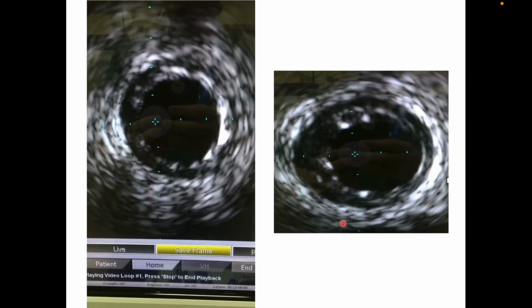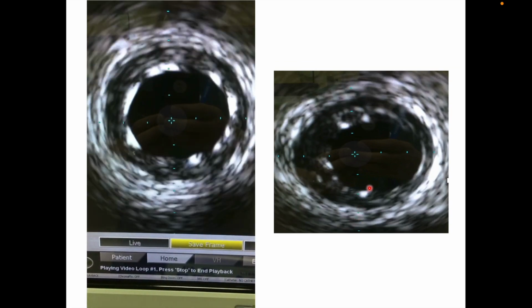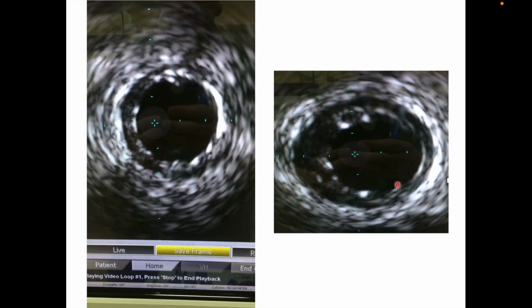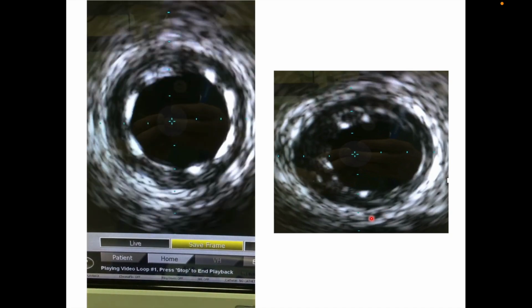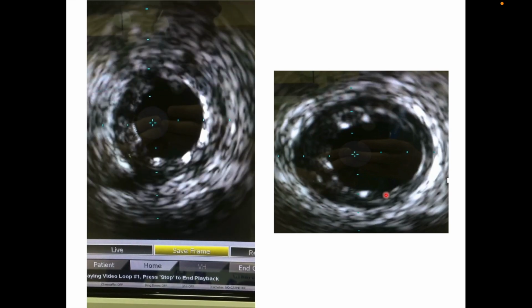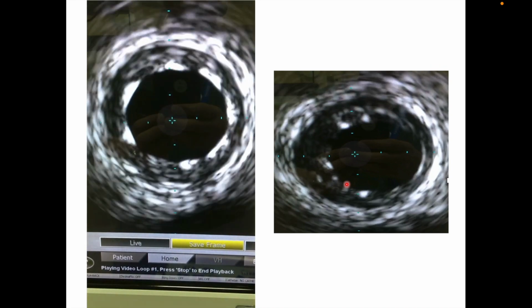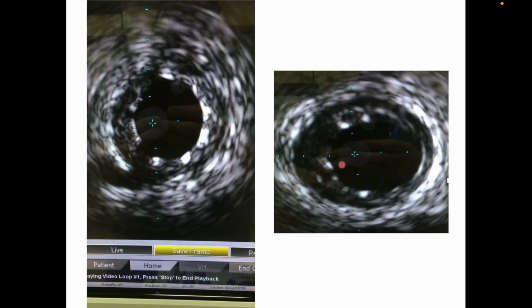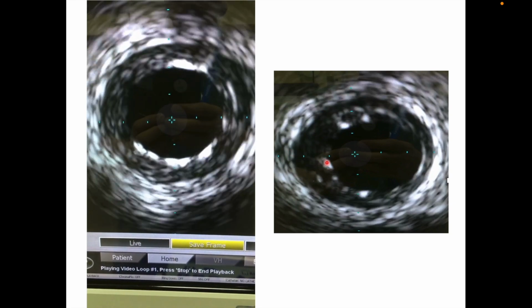That's the IVUS run. And what you actually see on this IVUS is that there are missing stent struts here. You can see here. So that's a fractured part of the stent, whether it was fractured initially and that led to stent thrombosis, or it is this 3.25 millimeter non-compliant balloon post-dilatation that led to the stent fracture. That's not for sure because we've done the IVUS only after doing the post-dilatation. But one thing we can see, despite post-dilatation, there is malapposition as well.